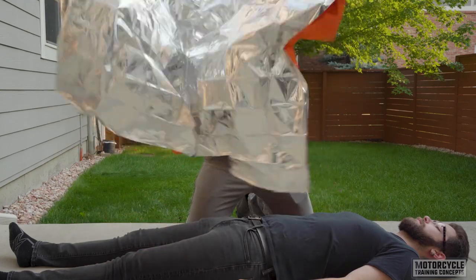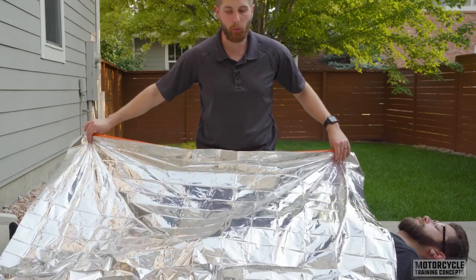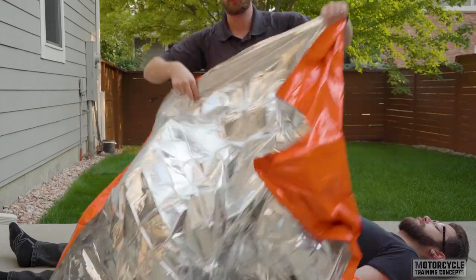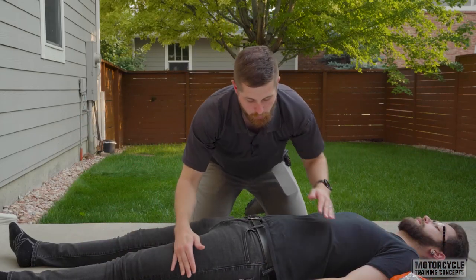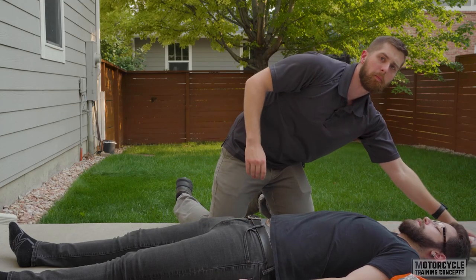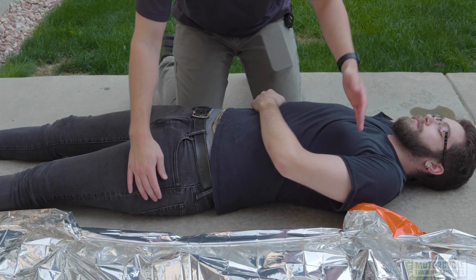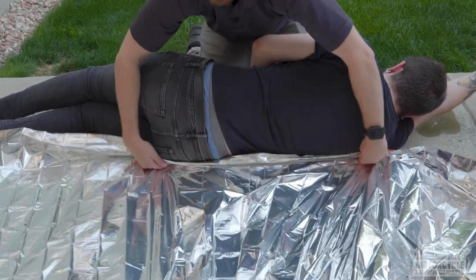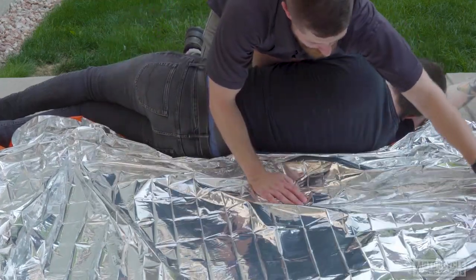For this, I'm going to unfurl the blanket and lay it how I want it to be over the patient. I want to make sure it's lengthwise, if at all possible, to encompass as much of their body as I can. First thing I'm going to do is lay it next to them. To roll them, I'm going to put them in the recovery position — one arm up above their shoulders, one arm right here. I'm going to roll them towards me and brace them on my leg as I bunch this up until it's about halfway under them.